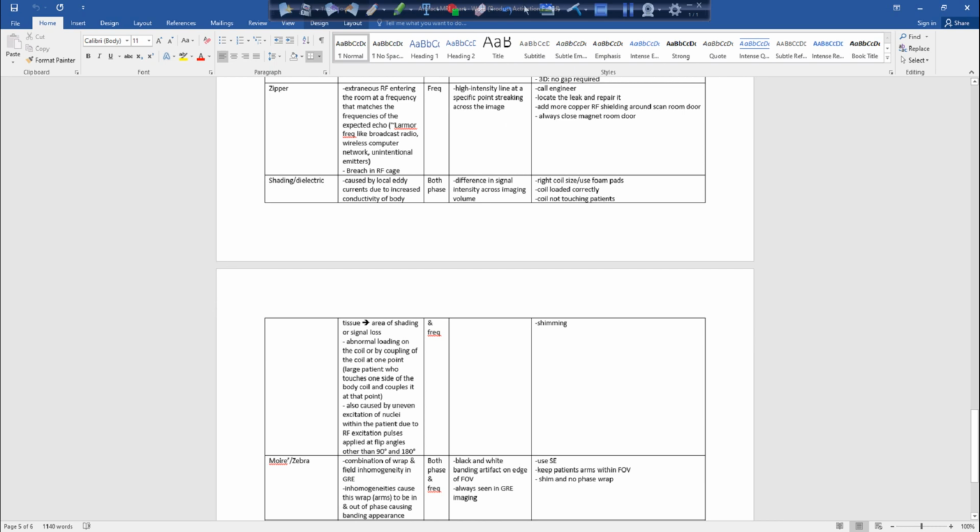So remember, when you are positioning a patient, you don't want them to be looped in any way, right? Because if you loop in a magnet, it can create burns where you're touching. You could basically create a shock voltage within the patient. When you position for a lumbar spine or an abdomen, people tend to just do stuff like that. Don't allow that to happen because you're creating a loop. Anytime you have a loop within a magnet, you can create a voltage.